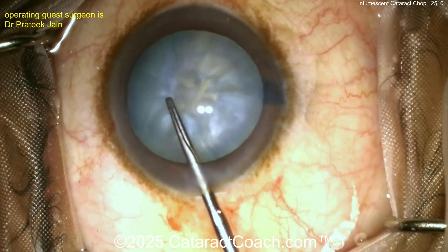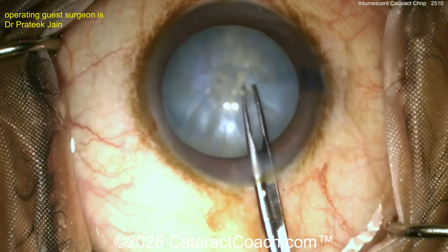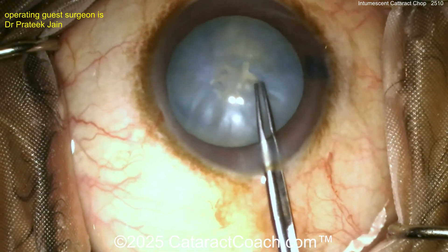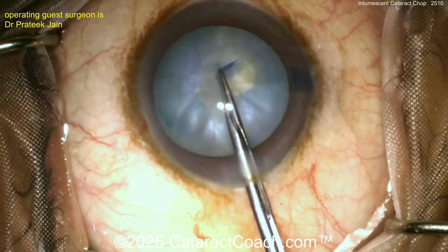Well, this is a nice way — by poking in many times here you're kind of giving it a release path so you don't get any radialization. That's a nice technique. I like that — thank you for sending that in. Now starting off with the grabbing with the forceps to get that rhexis done.